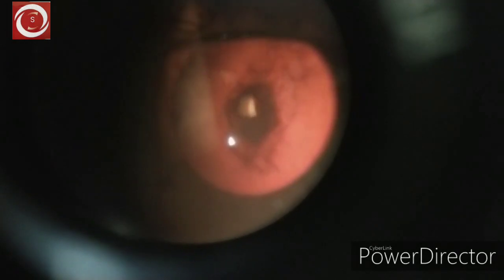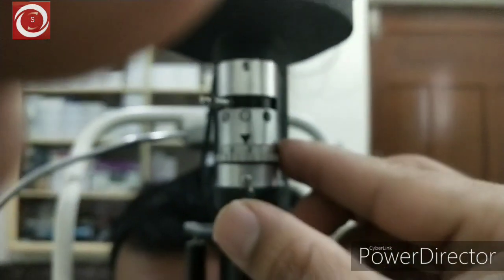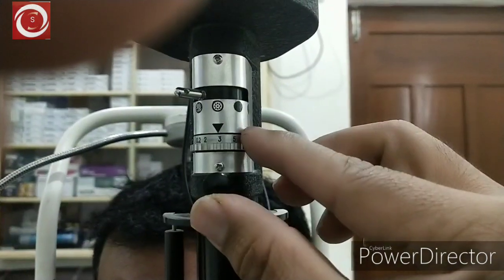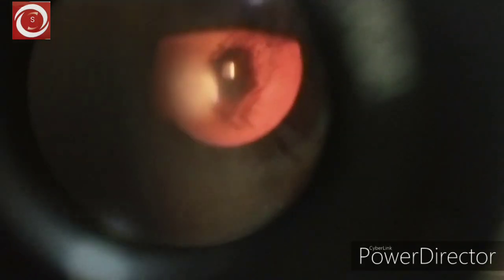I have already discussed the ways of retro-illumination. For retro-illumination it should be straight ahead and on the edge of the pupil — that's retro on the edge of the pupil. For trans-illumination you should keep it low so that the light goes into the pupil. Now our light is going into the pupil; it will do retro-illumination as well as reveal any defects in the iris.